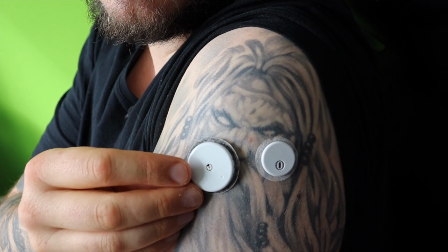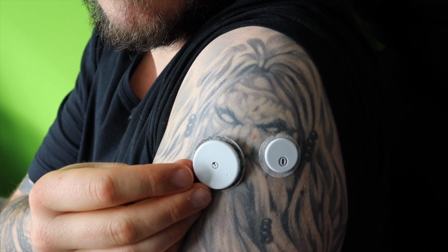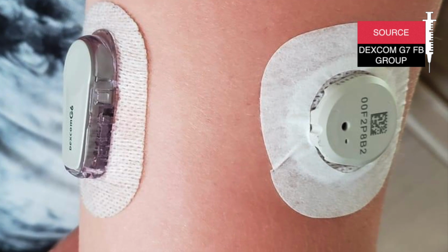When it comes to size, Libre 3 is a clear winner. It seems to be smaller, thinner, and I can imagine it will be more comfortable to wear for most people. I really like that design.